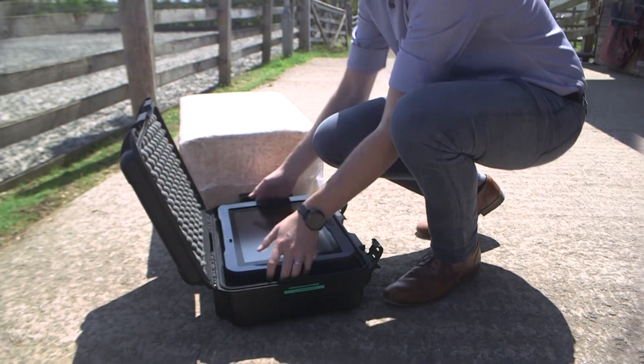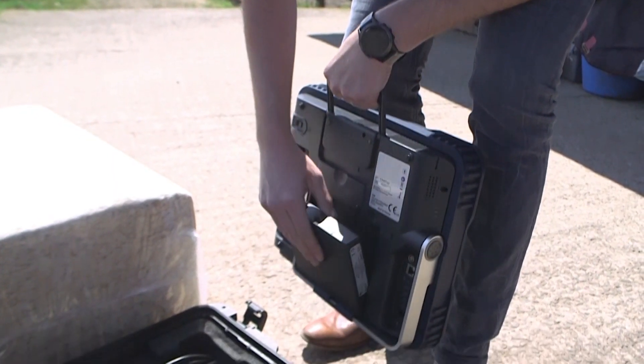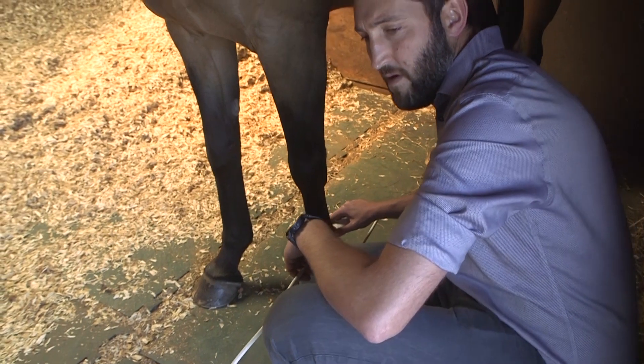Each interchangeable battery holds enough charge for more than two hours of scanning, keeping up with your busy day in the field.